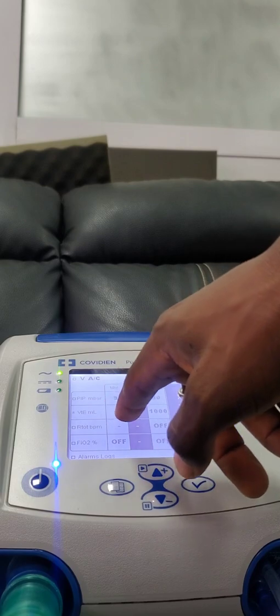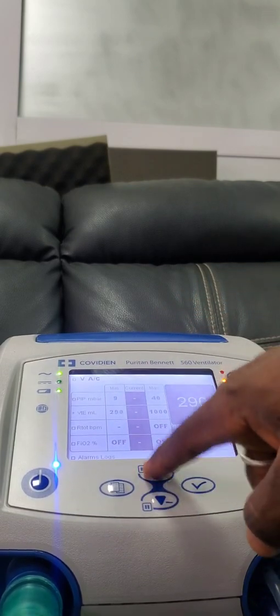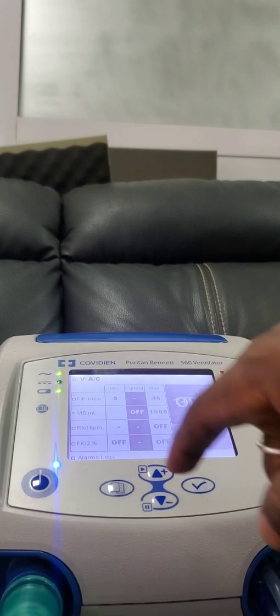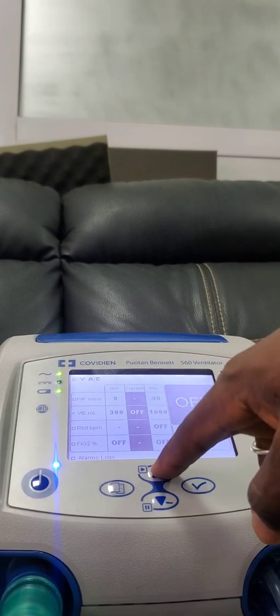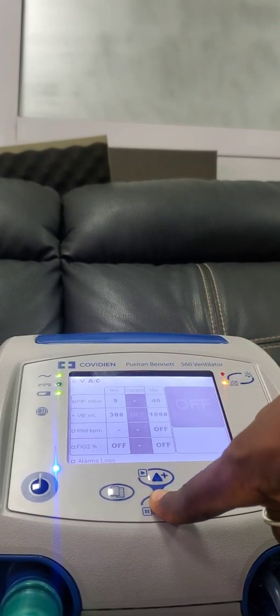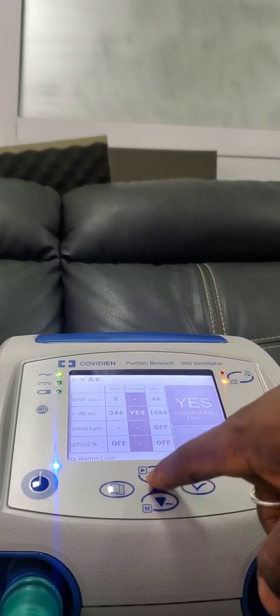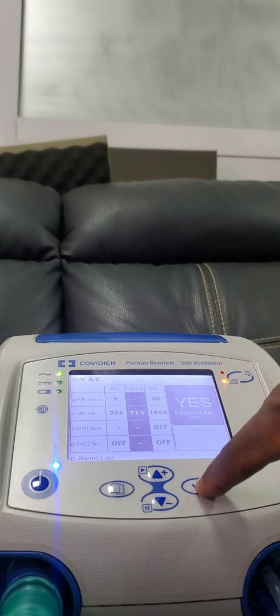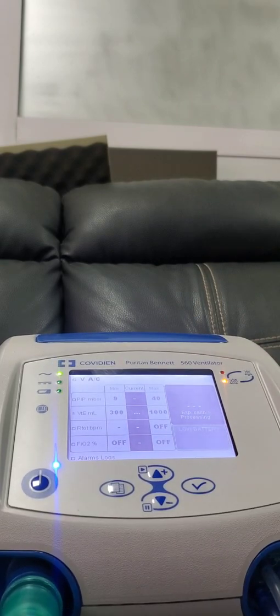Then you click on it — you see this 300 blinking. Then you can choose your parameters and you click on it. They read, for instance, 300.